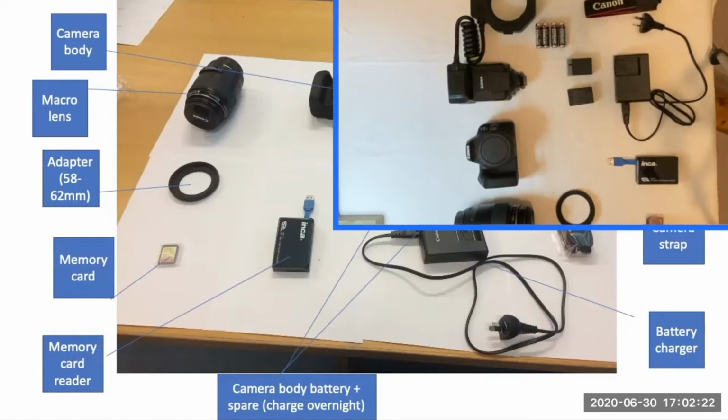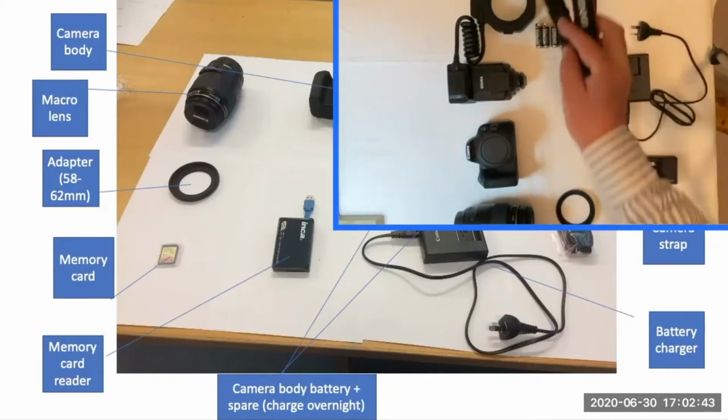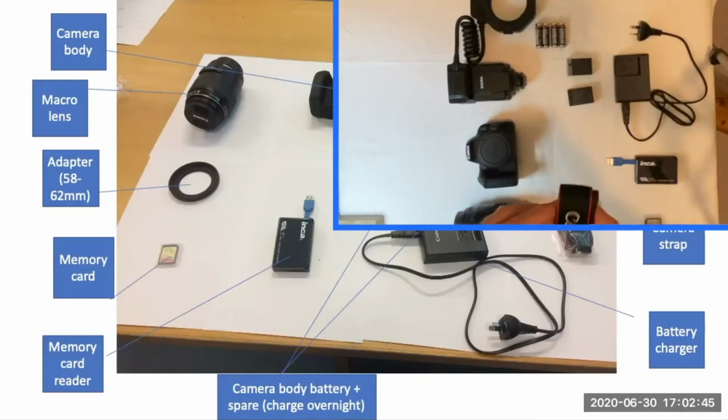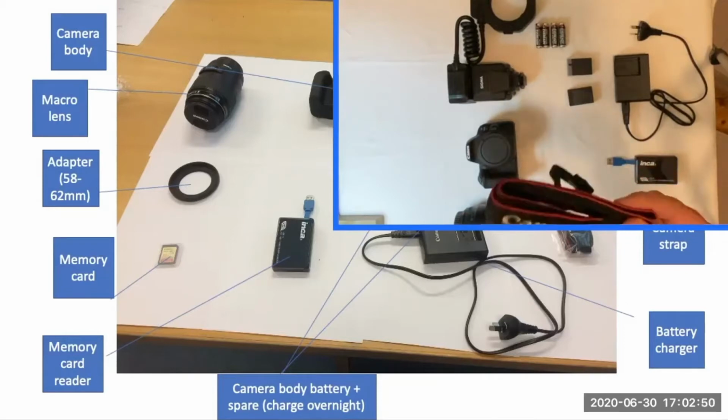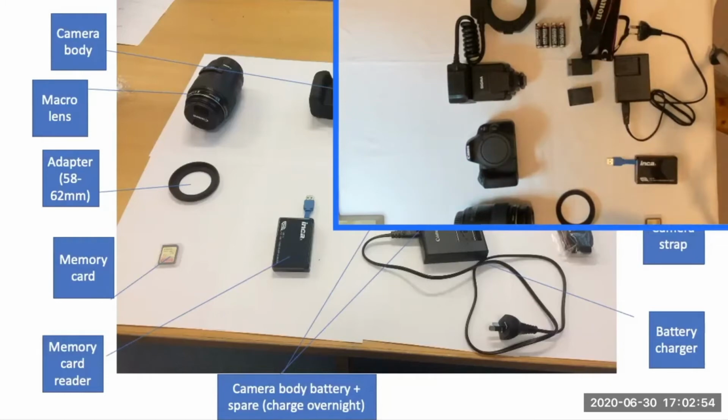The compact flash card, of course, to record things, and to get the pictures off the compact flash card you'll need this, which you'll plug into your computer as an adapter for the SD card. It's not a compact flash, it's an SD card. And probably the most important is the camera lens, as well as the strap for the camera that I'll show you how to put on so that you don't drop this rather expensive piece of equipment.